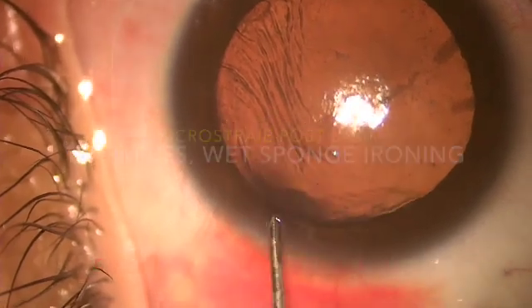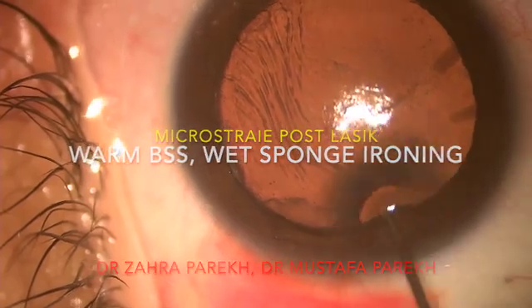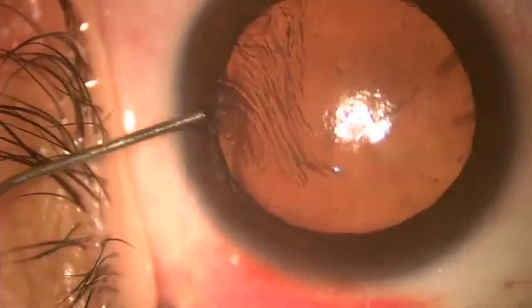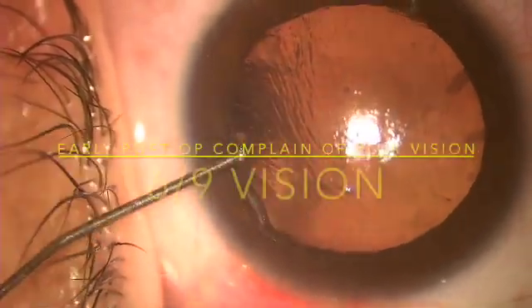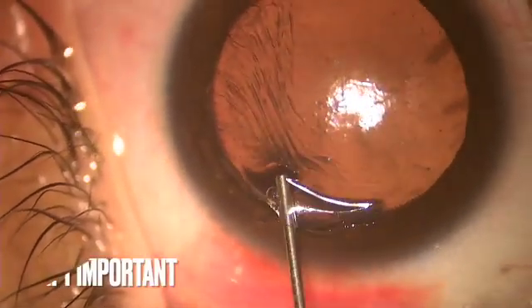Hi, we are going to be talking about microstriae post LASIK. Here, what we are doing is trying to find an edge. You can see these folds which are there just encroaching over the central area. With the speculum, this patient was complaining of slight vision loss. Vision was 6/9, 20/30. We are trying to lift the flap.